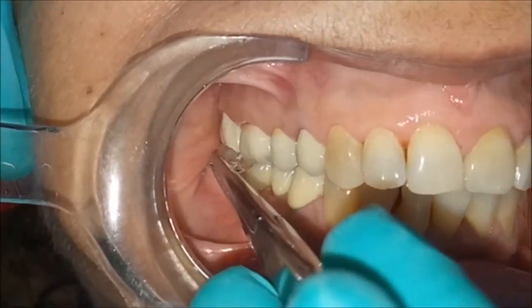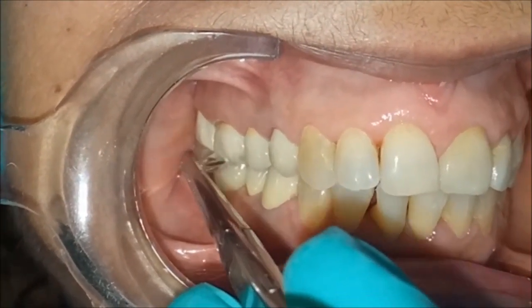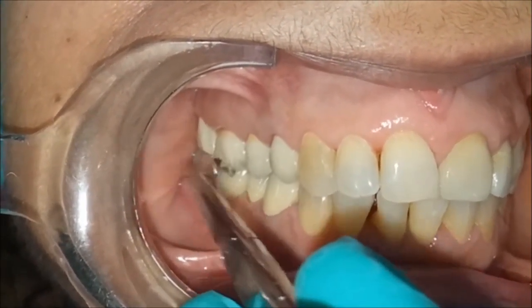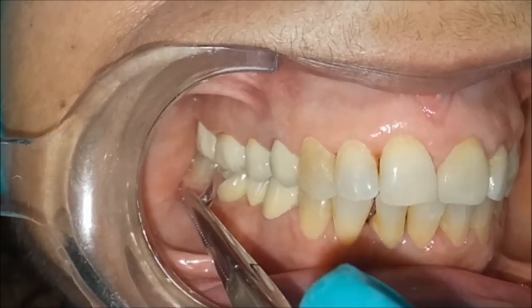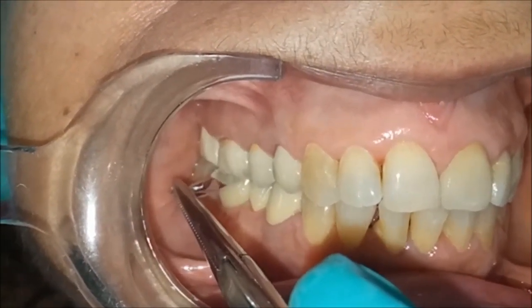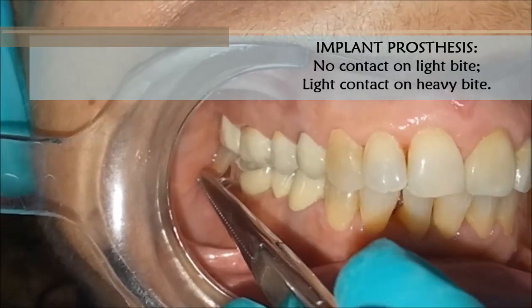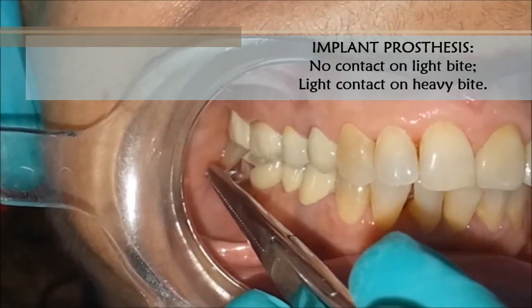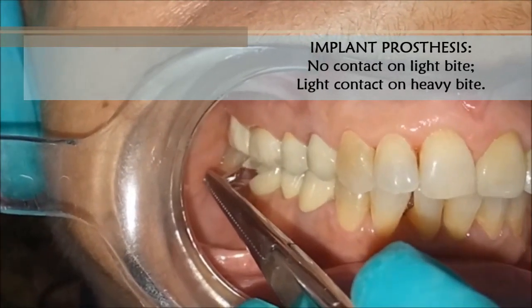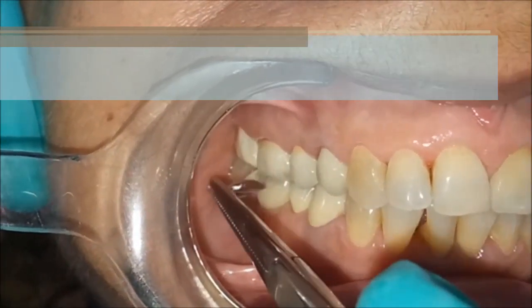Close down and bite again. However, when my patient bites down heavy — just clench down on your back teeth — you can see it is giving me a tuck back and resistance to pull. This is what I want ideally on this implant crown. In light bite, absolutely no contact on the implant and the shim stock should pull through. However, the moment my patient clenches down, the adjacent natural teeth intrude and my implant crown is now giving me resistance to pull.